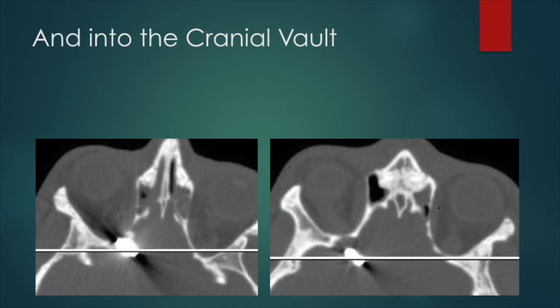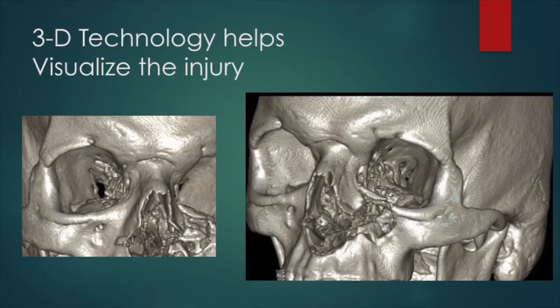So this would be a case where you really want to know where you are because the anatomy has been distorted. Okay? So we use image guidance on this. Now some other advances that we have, the hospitals can do this here, and I don't routinely do it for other things, but this is a 3D reconstruction. So it shows the entry wound on the nose on this side, and it shows the part of the shrapnel up here. Now, I want you to look at the outline of this.